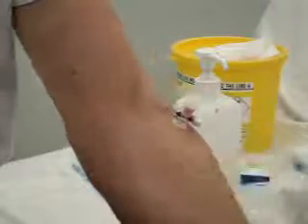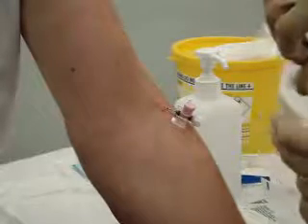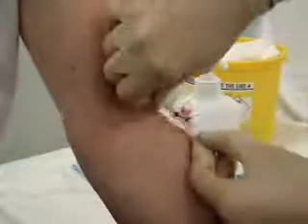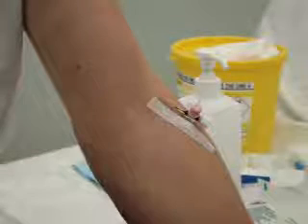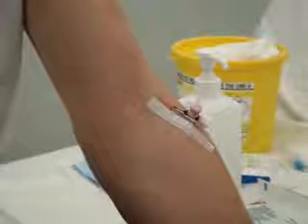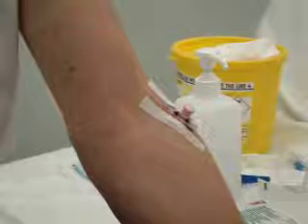What remains left to do now is to put a cannula dressing over the top, and these come by lots of different names, terms such as a Becker fix, but these are very simple. This is the one that we use locally. So it comes with two strips which you place down the side of each of the wings of the cannula, if you like. So one strip just there, one strip just here. Okay, and then the rest of it just goes over the top quite nicely.